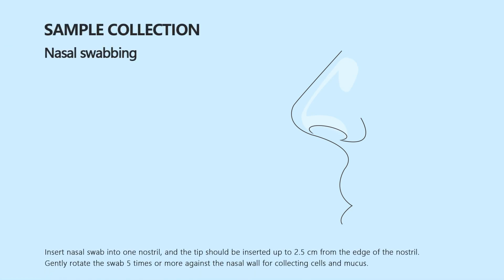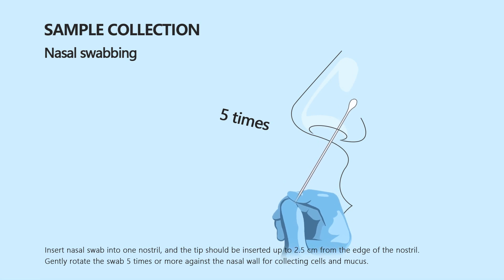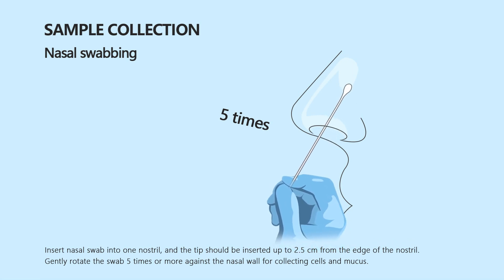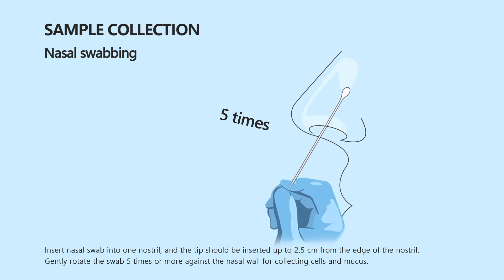Insert the nasal swab into one nostril; the tip should be inserted up to 2.5 cm from the edge of the nostril. Gently rotate the swab 5 times or more against the nasal wall for collecting cells and mucus.